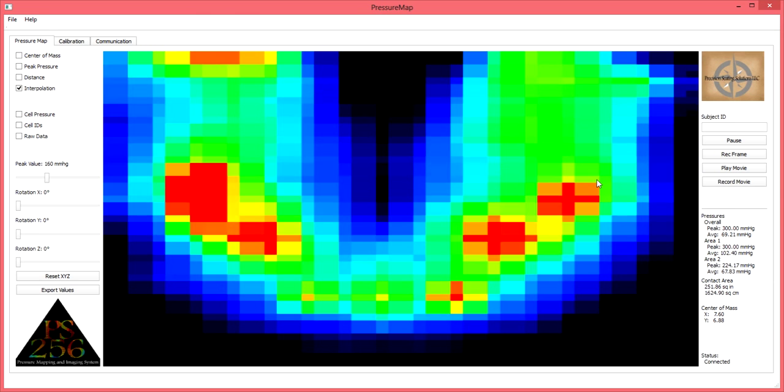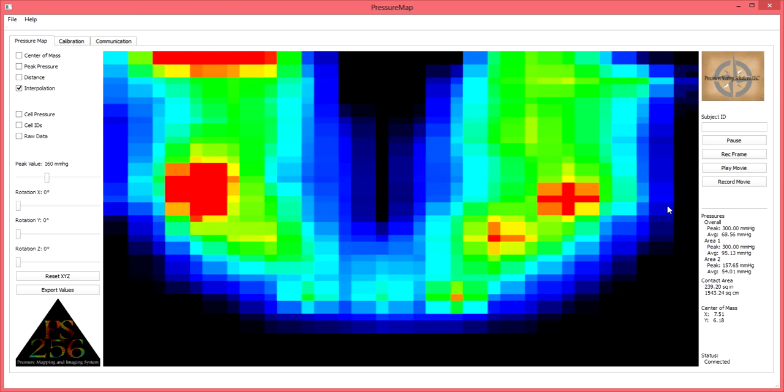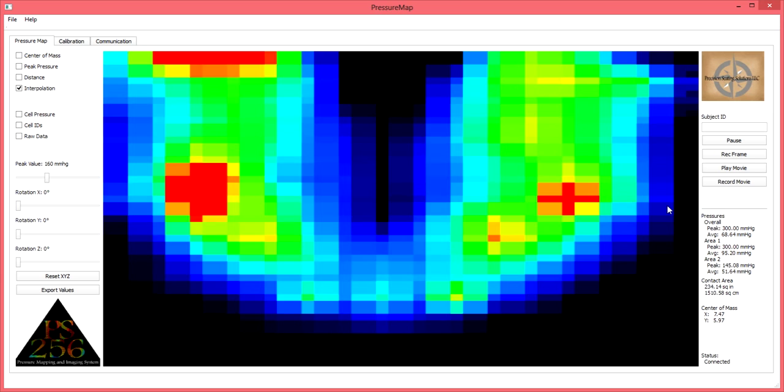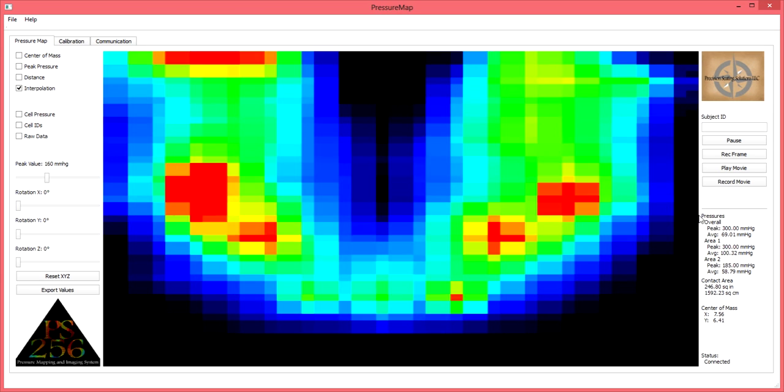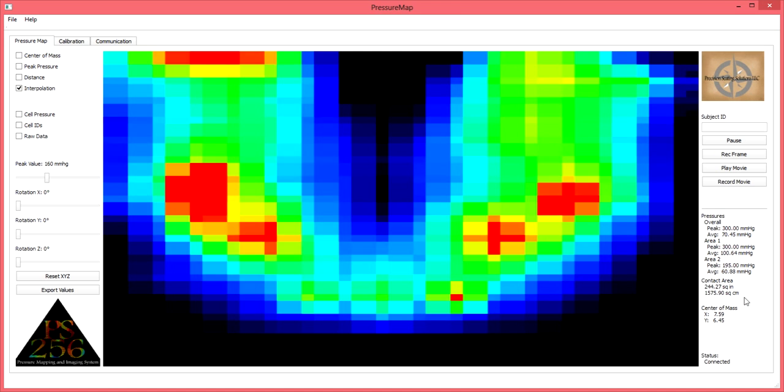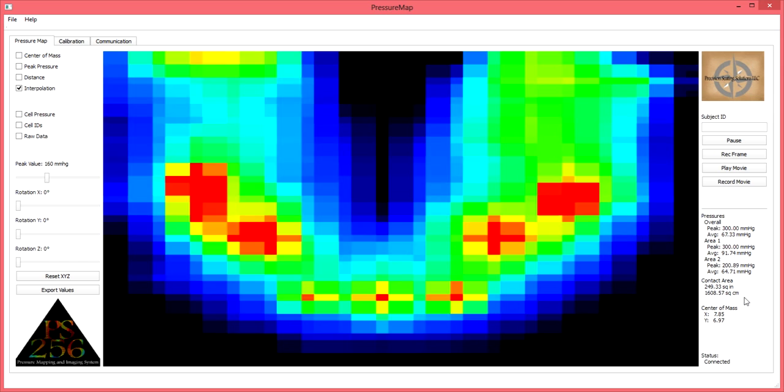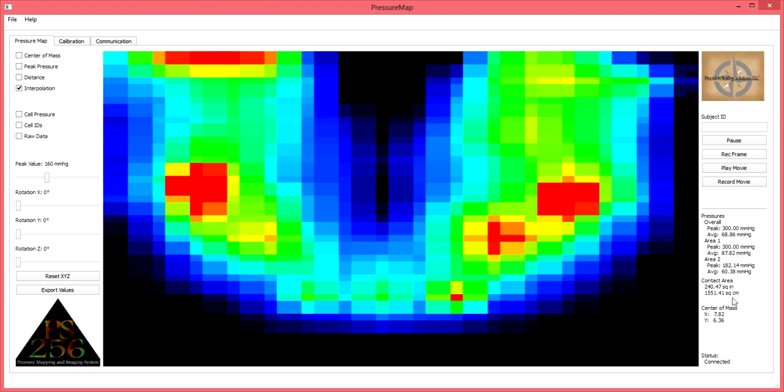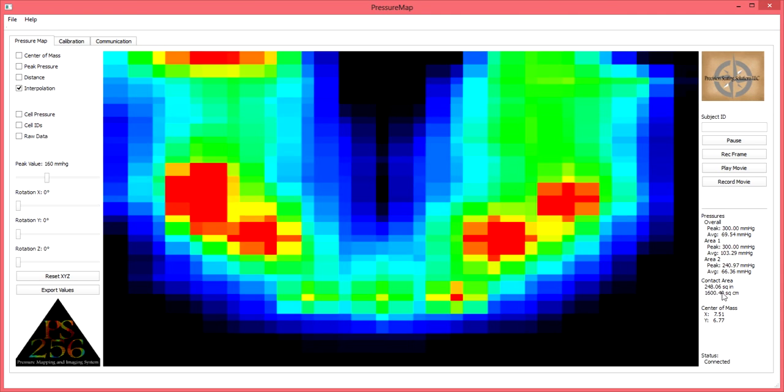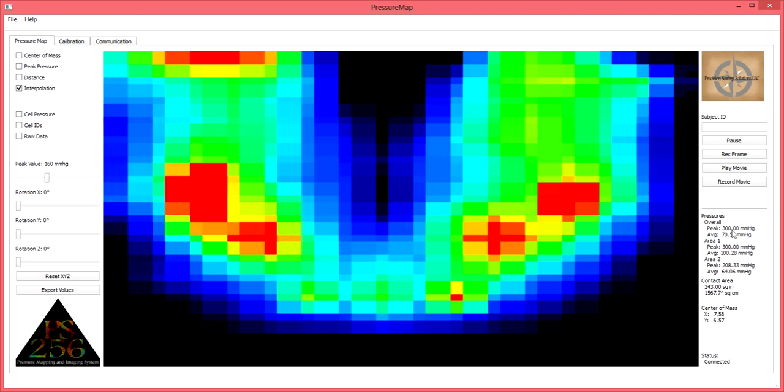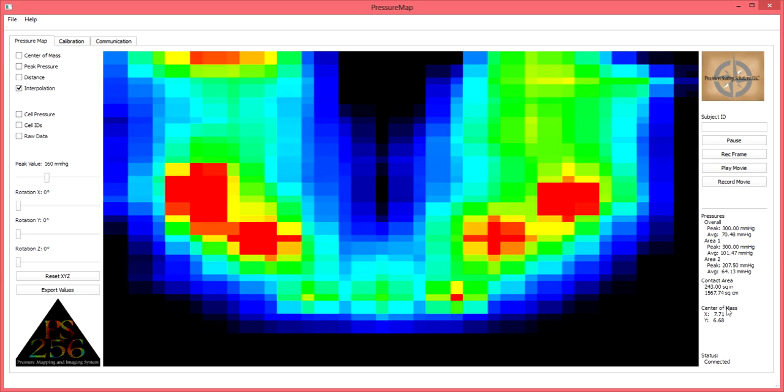We also provide a continual reading of overall pressures, pressures within the selected areas, and the amount of contact area being exerted on any given point in time. Again, please refer to our clinical applications tutorial for more information on the benefits of said pressures.